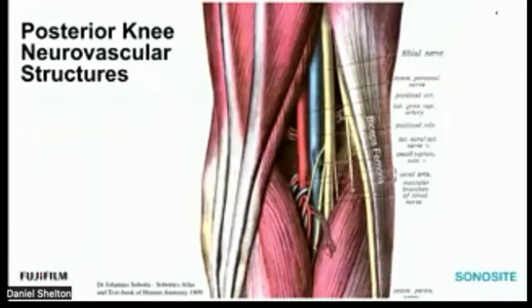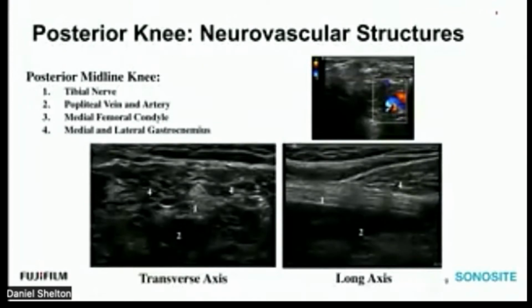And we're going to follow it up until we see the biceps femoris tendon. And we're going to scan the biceps femoris tendon just for our confidence level out here to the fibula. But then we're going to see a structure just posterior to that, and that's the common peroneal nerve. So we're going to be able to distinguish the peroneal nerve branching off the tibial. And then we're going to scan it distally and follow that tibial nerve. And we're going to talk about some other structures that may arise and look like a Baker cyst. And that can be some neurovascular malformations and such. So I just showed you this basically between those two heads of the gastrocs.